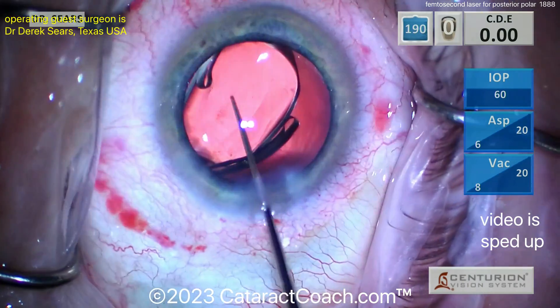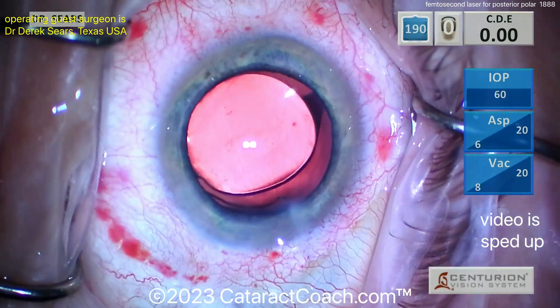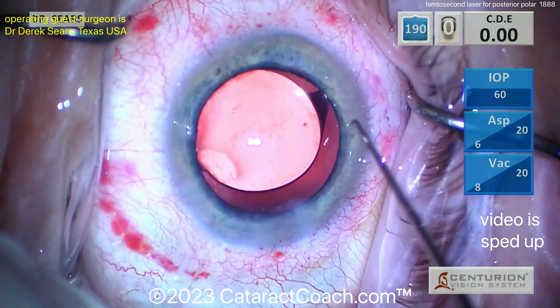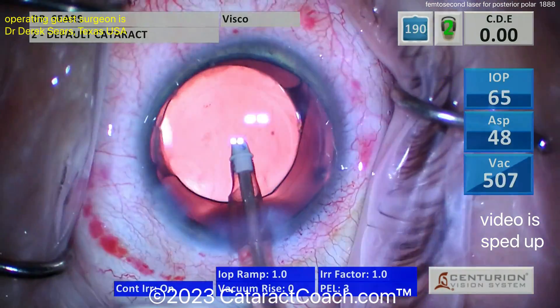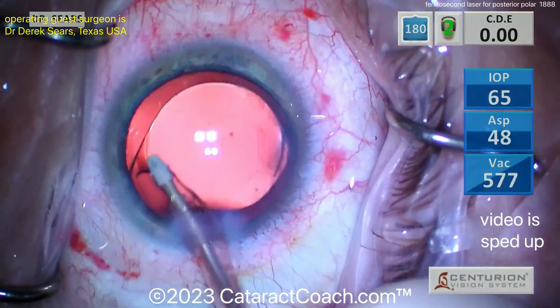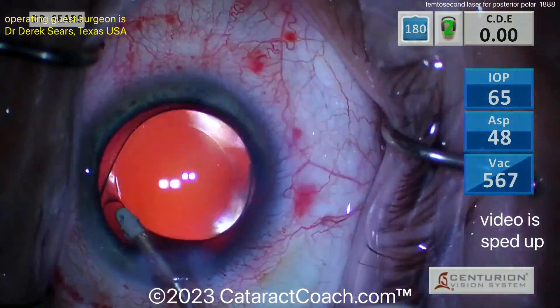Beautiful work here, doctor — I appreciate you sending the video in. We have a huge collection of posterior polar videos, a tremendous number. Now opening up the corneal astigmatic incisions that were created with the femtosecond laser, using a Sinskey hook to do that, and now taking the viscoelastic out.